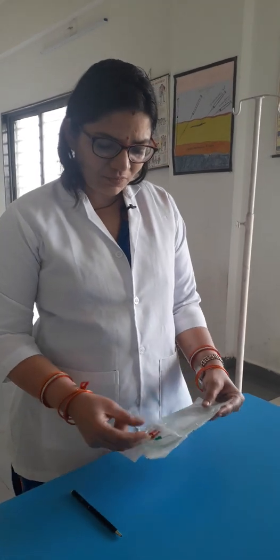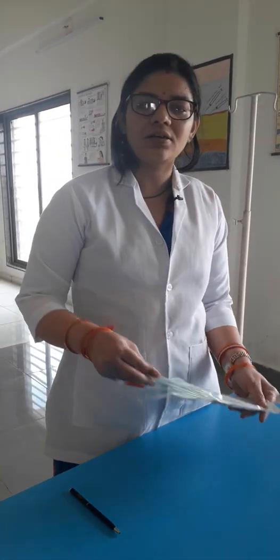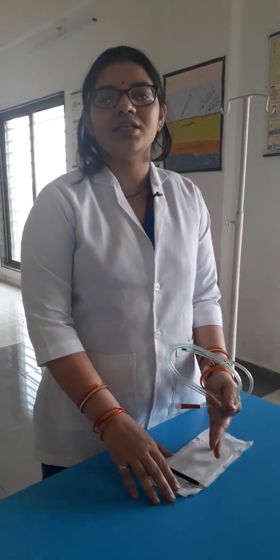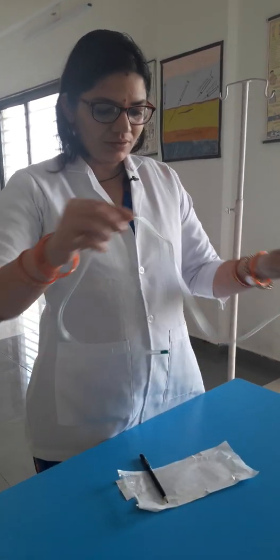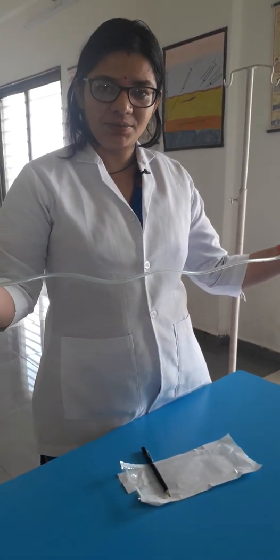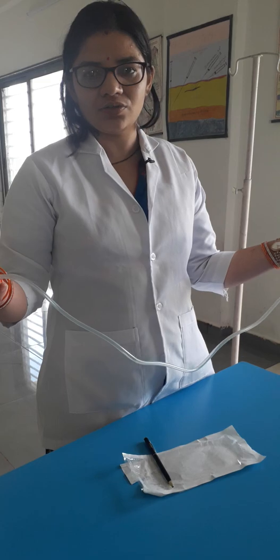It comes in different materials. The material used here is PVC, and it is also made up of polyurethane as well as silicone. The standard length commonly used is 125 cm.